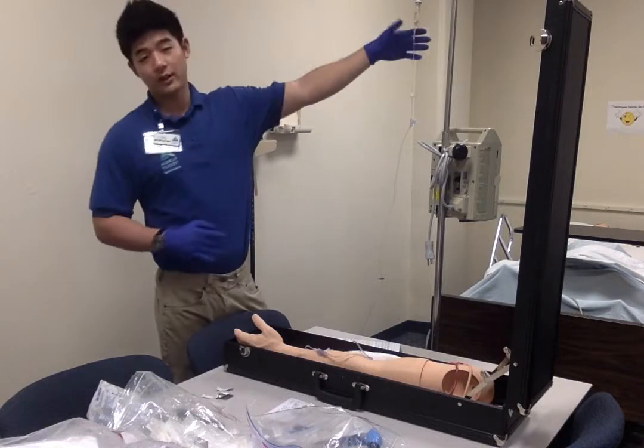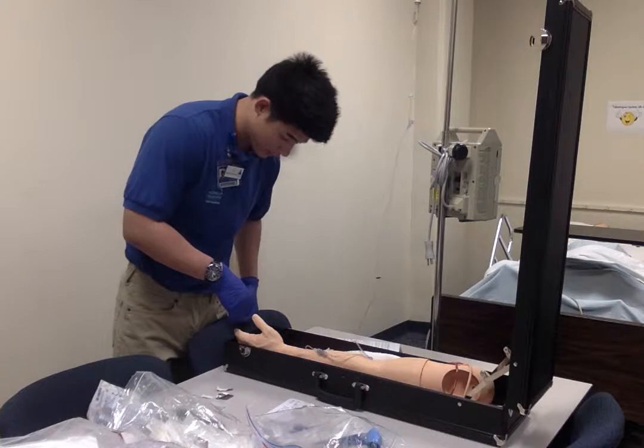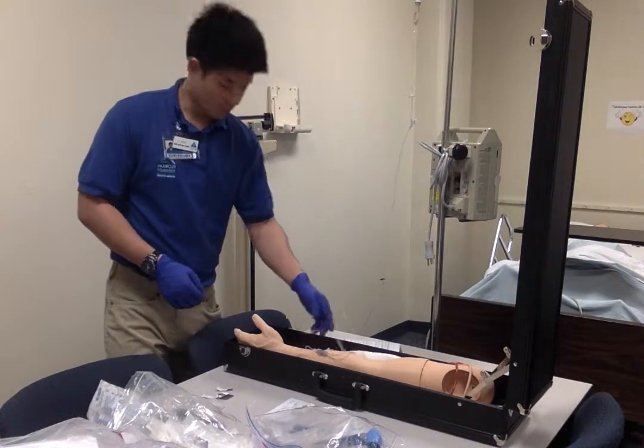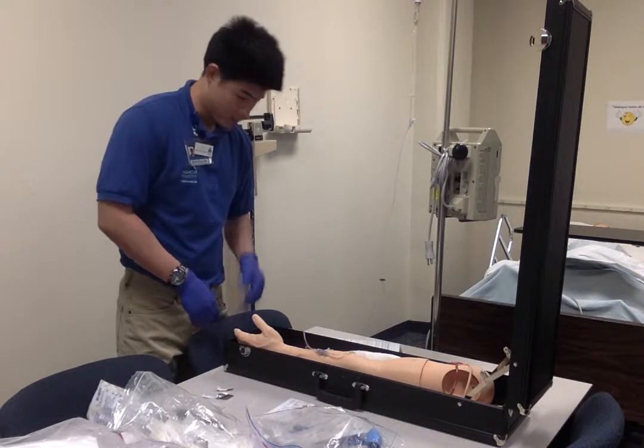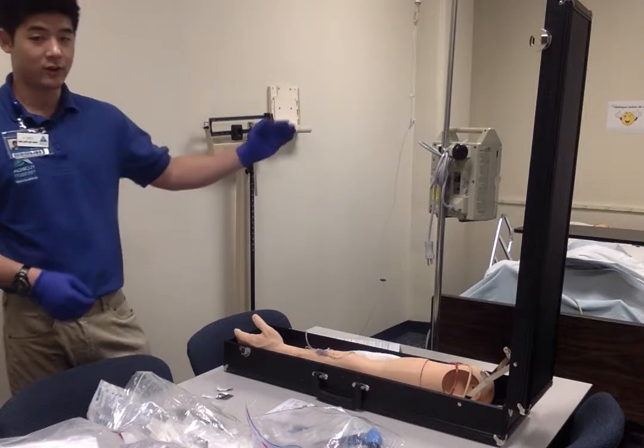So let's just say that we did this, and I'm going to check for anything that's abnormal. And what I'm going to do is take my gloves off, do my hand hygiene, and then wait till this is done.